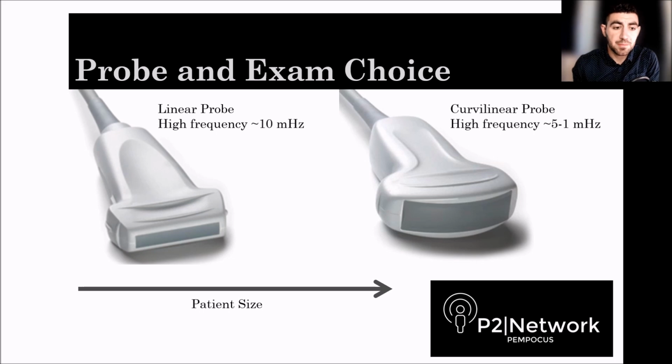As you're approaching a patient, it's important to select the correct probe. For smaller kids, I use the high frequency linear probe because you can get a lot of detail about the pleura. And because they're small, you can actually get some deeper parenchymal information as well. For larger kids, I'm using the curvilinear probe. Generally, we're using either the lung or abdominal preset. If your machine does not have that, sometimes I will use the vascular setting to evaluate the pleural line.